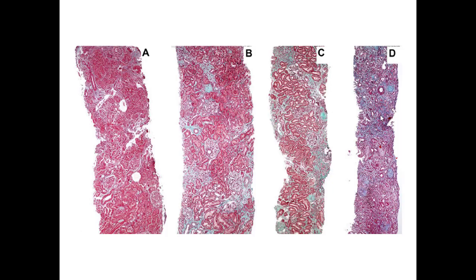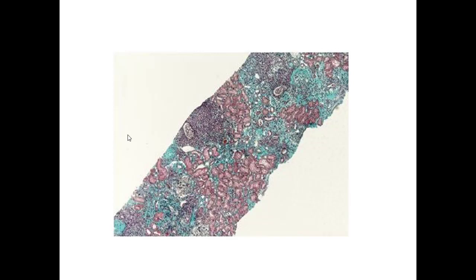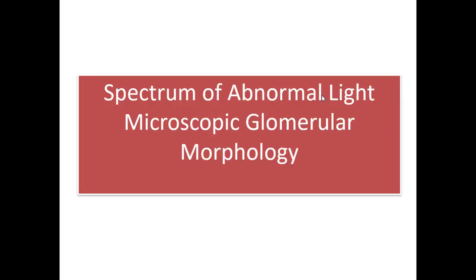So from the first look at the low power, I can know that this patient has a very bad prognosis, and this patient is a good patient. Okay, this is how the low power helps us to know the problem. Again, this is a severe form of fibrosis, moderate to severe. And those patients with more fibrosis are not likely to improve even with treatment. This is a very important idea to tell the patient about when diagnosing him for the first time.